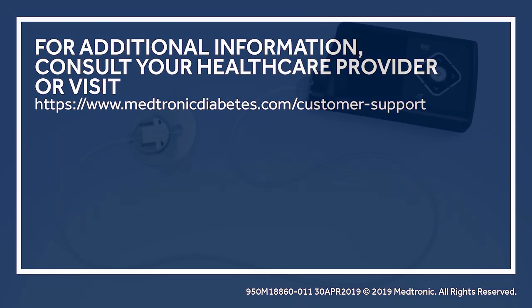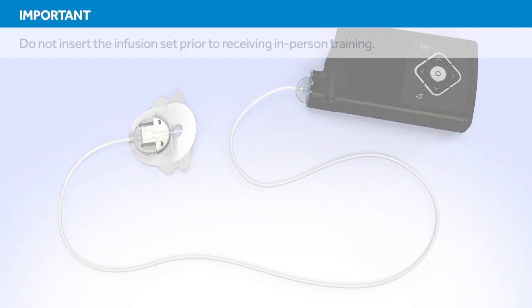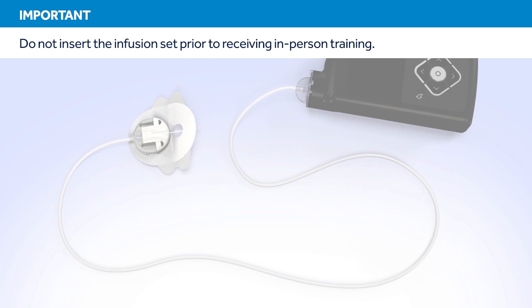Welcome to the Medtronic online training for changing the MiniMed Silhouette Infusion Set. This course will show you how to fill the reservoir and insert the infusion set. Do not attempt to insert the infusion set prior to receiving the in-person training.